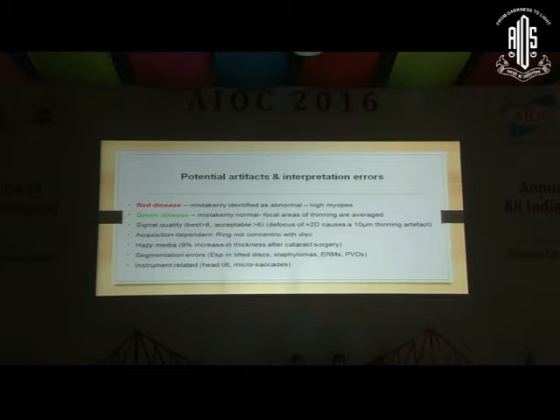It's important to have a good signal quality because a defocus of even 2 diopters will give you a 10 micron thinning artifact. Acquisition, we've already discussed, the ring must be concentric with the disc. And patients with hazy media will have an artifactual RNFL thinning, so much so that after cataract surgery, you will find the RNFL is improved.